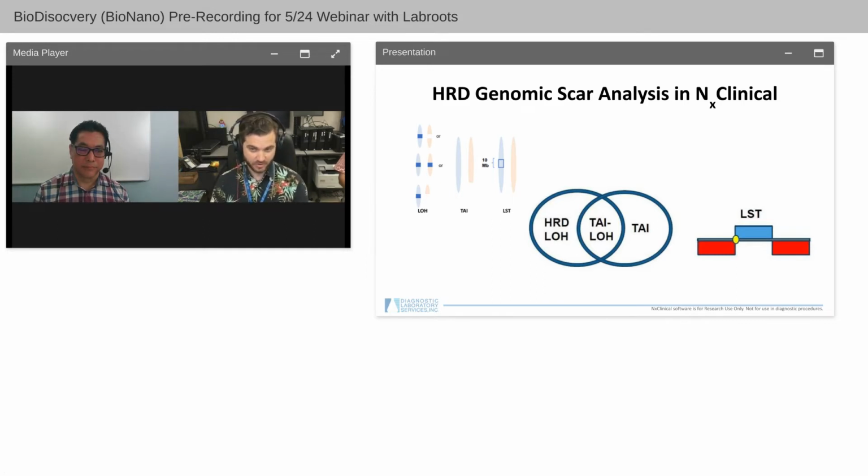Also, to the right, you can have shared LST changes. And as we said, we need to distill to the breakpoints. So in evaluating it, we can have 2 things co-occurring and so evaluate that both things are co-occurring.